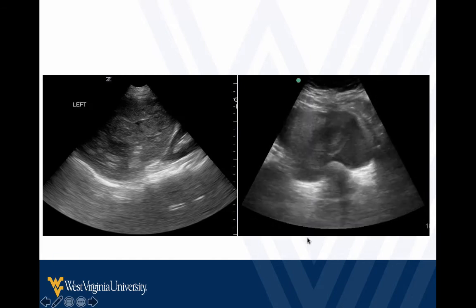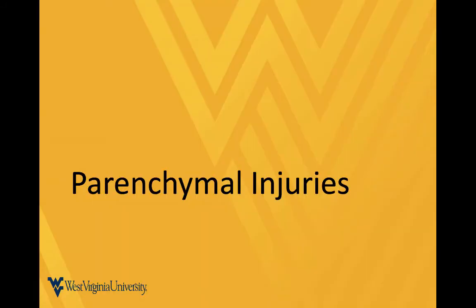And just, again, important example that blood anywhere in the body is not always black, free fluid. When it starts to clot, it starts to look gray. Don't miss it because you were only looking for black. So that's really the FAST exam.